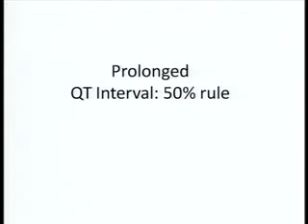Now, one of the most important things which have come out in modern times is the prolongation of QT by many drugs and electrolytes, which we many a times miss. And I have seen amiodarone given to people who have hypokalemia and people precipitated with a torsades-de-pointes. So it is very important for us to recognize whether the QT is prolonged, because many antipsychotic drugs, many of the drugs today prolong the QT and it can result in sudden cardiac arrest. So I want you to look at the QT interval for all patients, especially when you are in the ICU. You have to look at it. If you miss it, then you're going to create a problem for the patient.